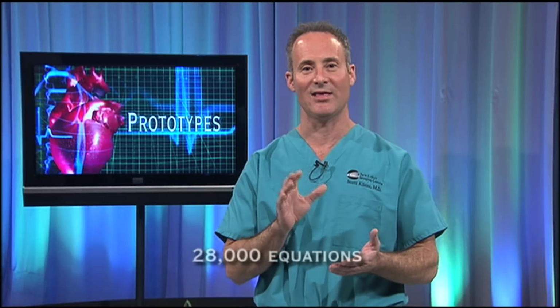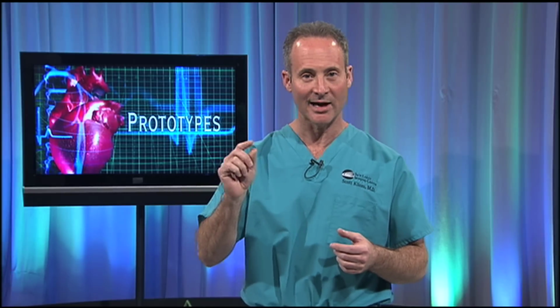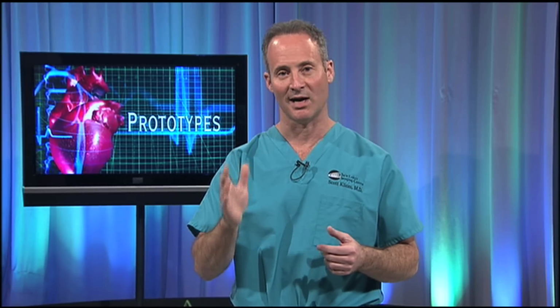Absolutely not possible. It then took a supercomputer at the time about 2.5 hours to process that information and reconstruct a single image. And this is that image. And the computer at the time, programmed in Fortran, had to solve the equivalent of 28,000 simultaneous equations to reproduce that particular image. And although clinically not feasible, it did show that the technique of computerized tomography was physically possible.